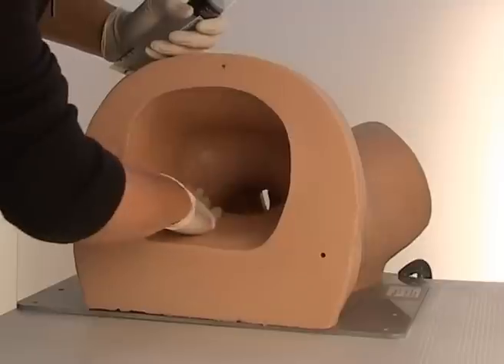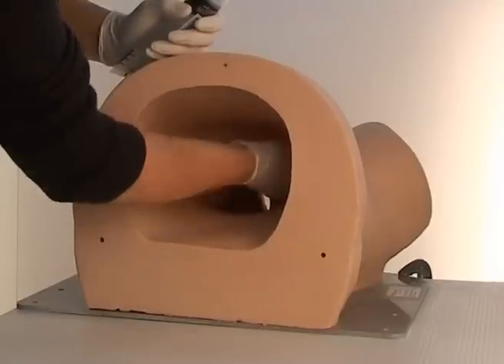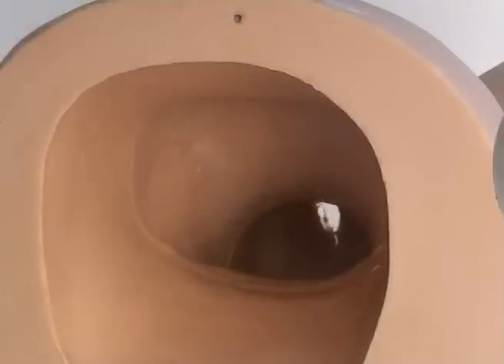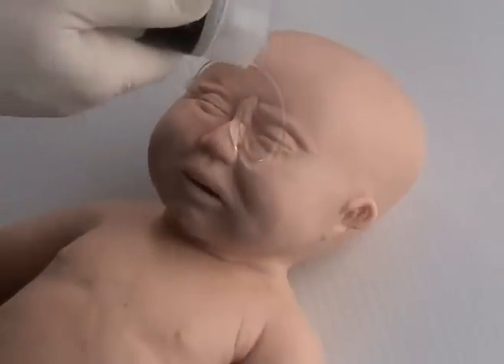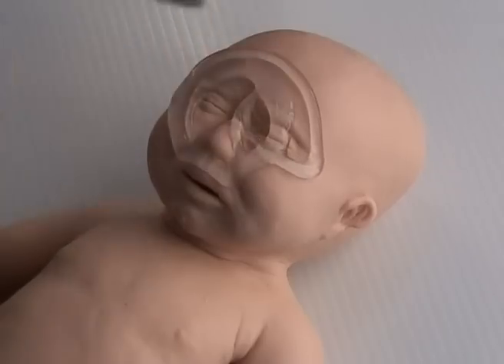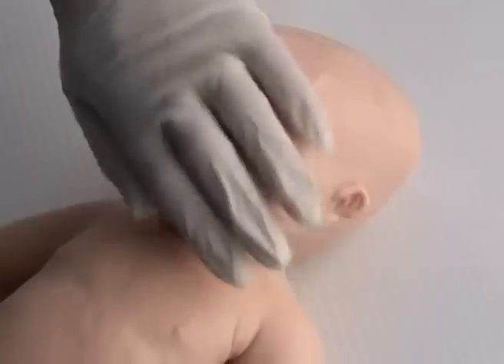Please note that ultrasound gel does not work at all and should not be used. One or two squirts of water can help make the inside even more slippery. Now cover Sophie with a generous quantity of lubricant from head to toe on both the back and the front.